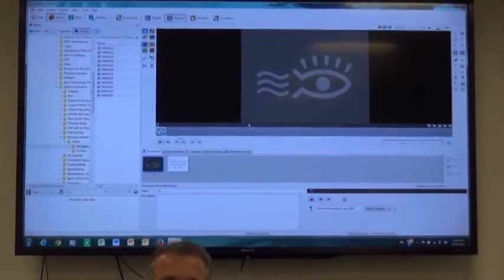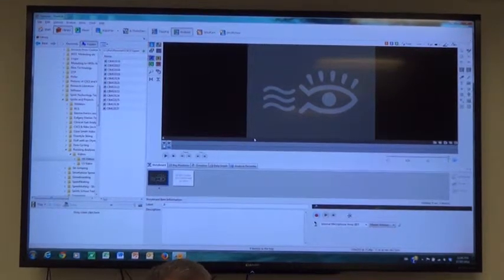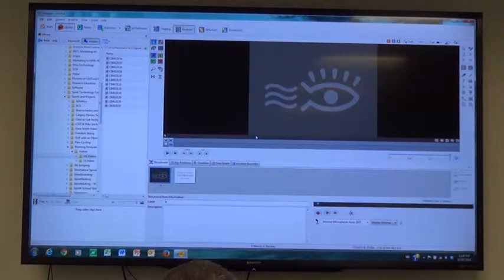Triathlete. This is a running analysis that was done. We just collected some video yesterday. The purpose of doing this assessment was to help the medical professionals clear her for competition because she's had a stress fracture, or stress fractures, in one of her feet, and they were just looking for a biomechanical assessment to see how she runs and what she does, and also how she runs in a couple of different conditions, that being without orthotics and with orthotics.